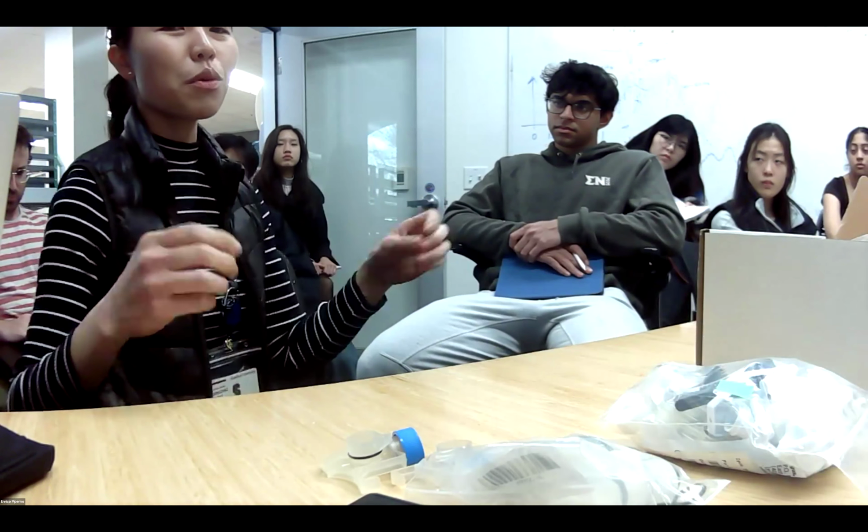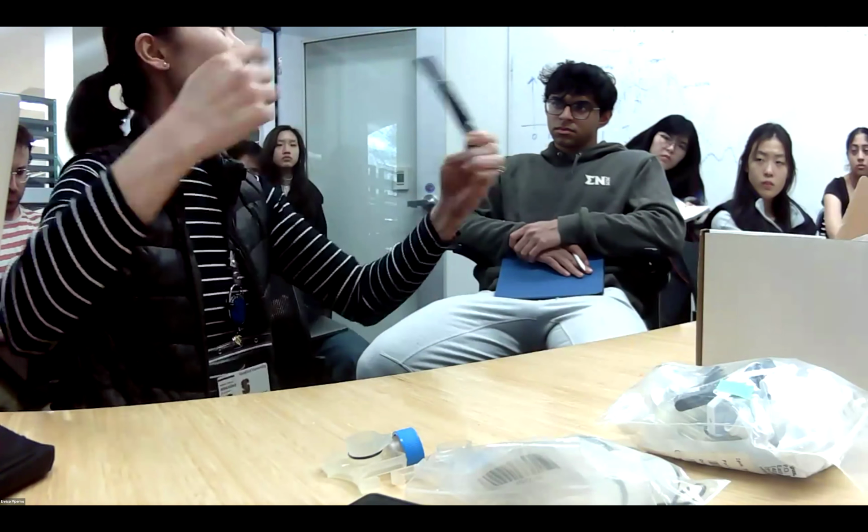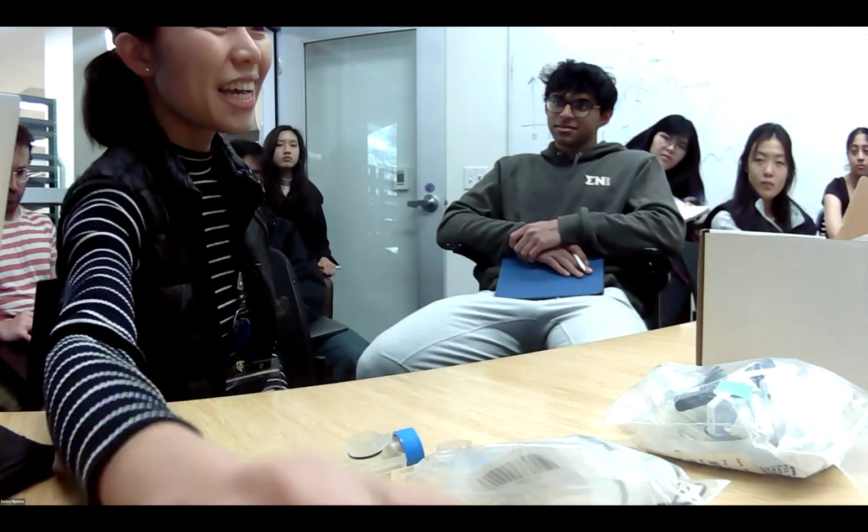Like at one point, I don't know if you're familiar with the paperfuge. A lot of the sample prep typically required centrifugation to extract the DNA. So at one point we had a device that looked like this, where you would put in the sample and then fling it like a paperfuge, and we realized that was quite dangerous. So we moved away from that entirely, within like 2 days.